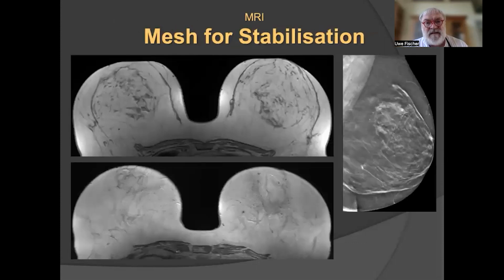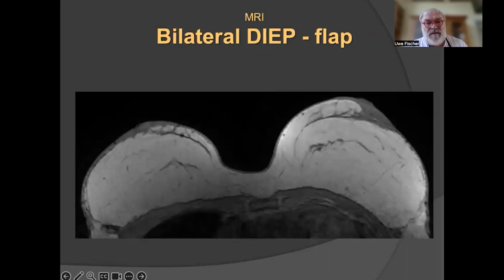And let me show, this is the situation before. This is a bilateral DIEP flap.